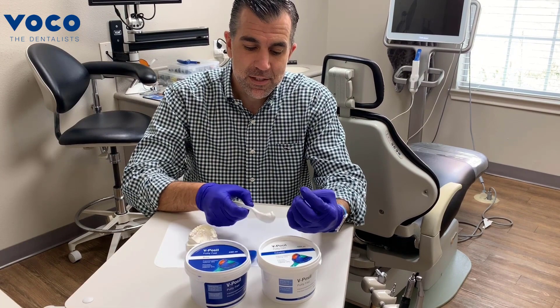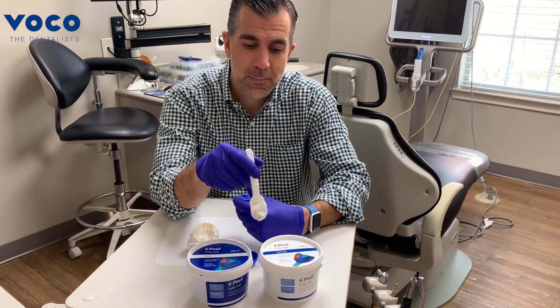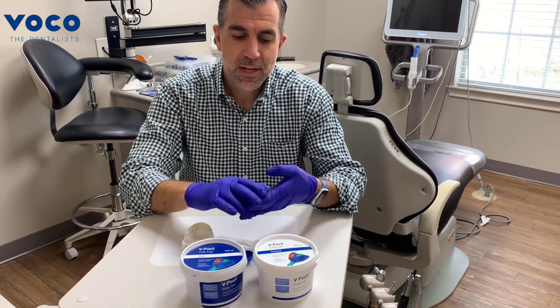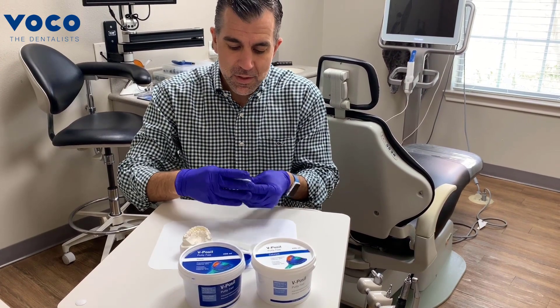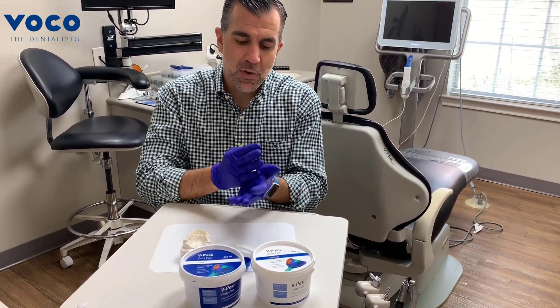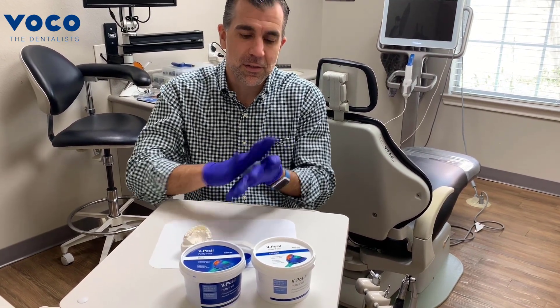I've taken about a half a scoop of the prefabricated scoops that come with the putty — of each the base and the catalyst — and I'm going to go ahead and hand mix those. You want to mix this to a consistency where there's no marbling, or that it's all an even color when you mix it.